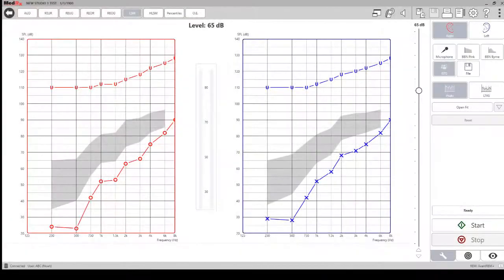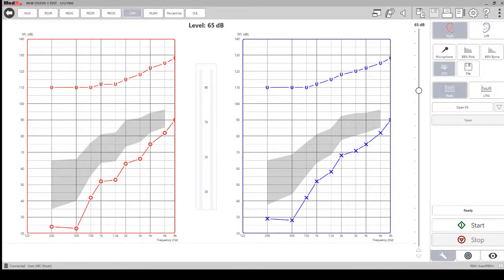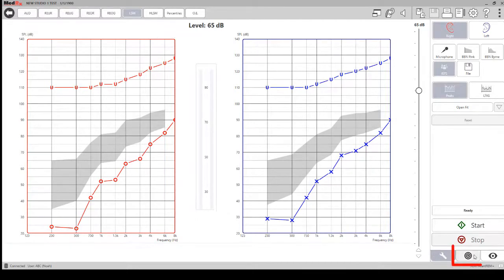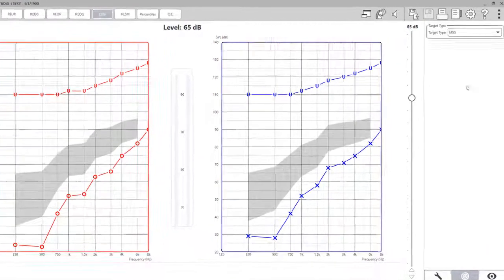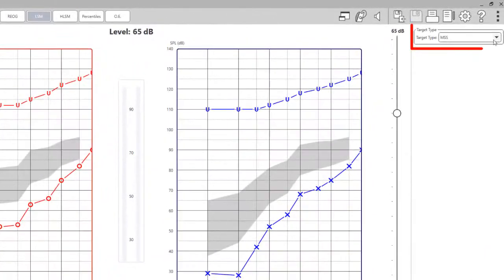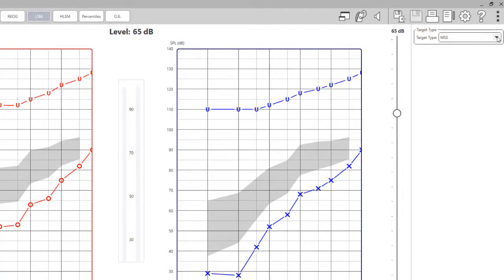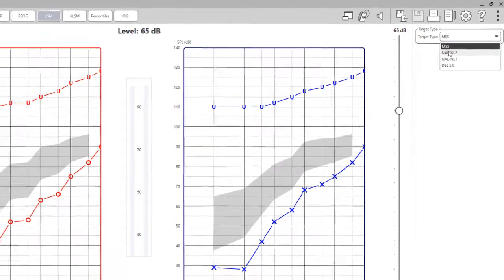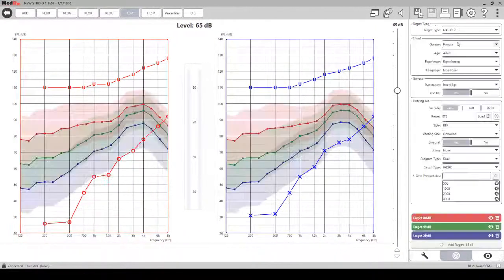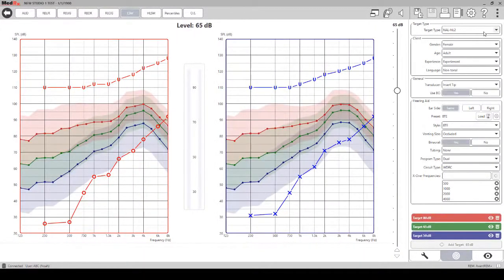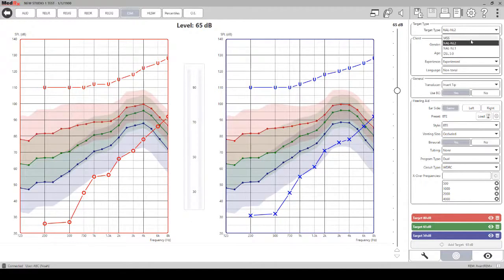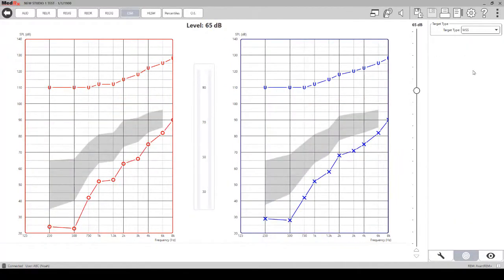On the right hand side of the screen you can change the characteristics of the test and the target types. You can click on the target tab at the bottom and this is where you can change your target type from either MSS or another fitting formula such as NAL2. When selecting NAL2, you will see the targets displayed on the screen. When selecting the MSS, you will see a gray area that you would want your curve to fall into.